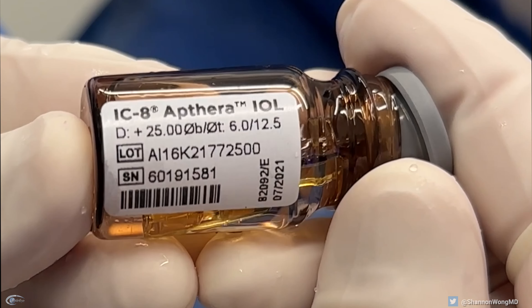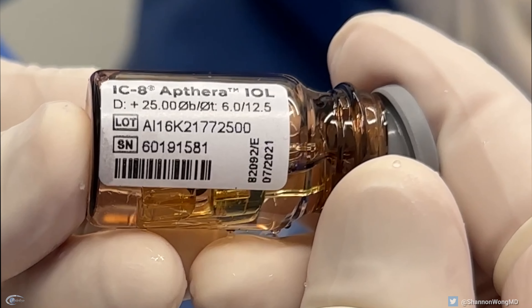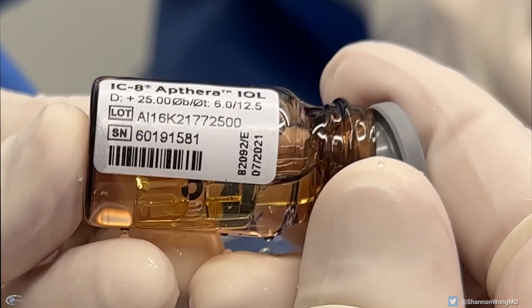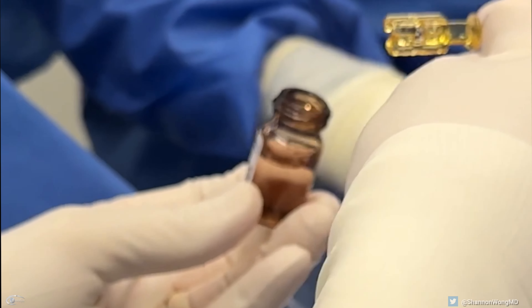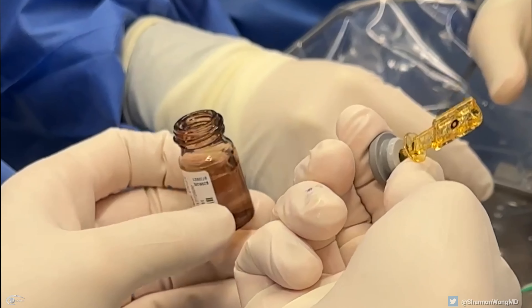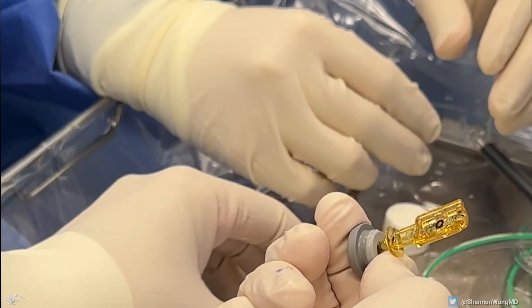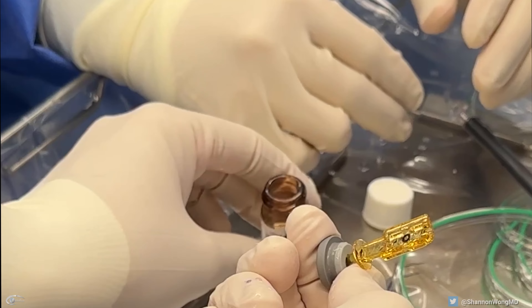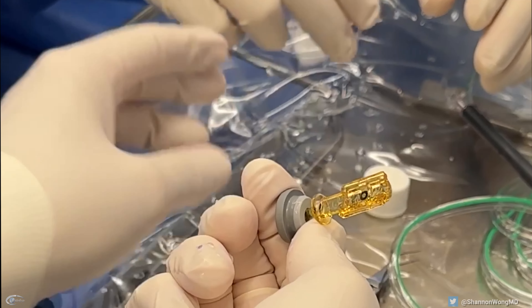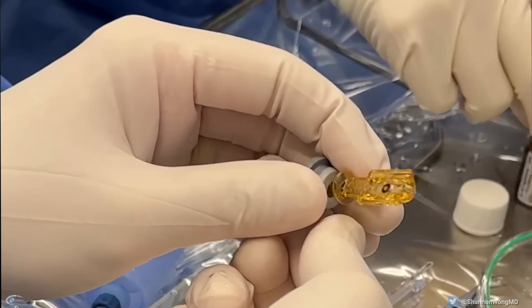First, in the operating room, the IC8 lens is stored in a glass bottle that resembles a bottle used to store a soft contact lens. The lens, which is immersed in a sterile solution, is attached to the rubber cap of the bottle. Once the cap is removed, we can see the IC8 lens attached to the cap in a prefabricated plastic mold.